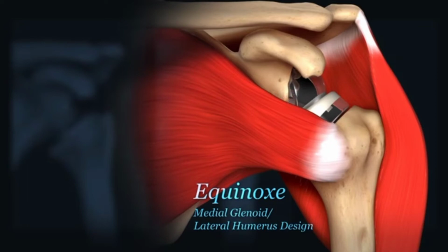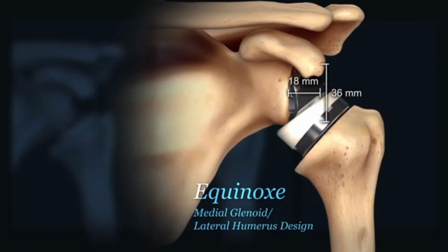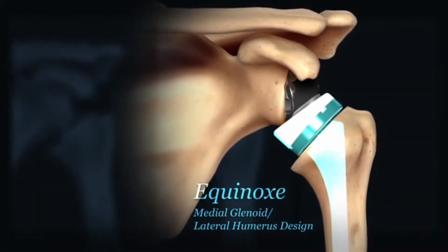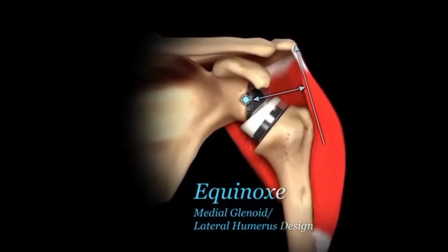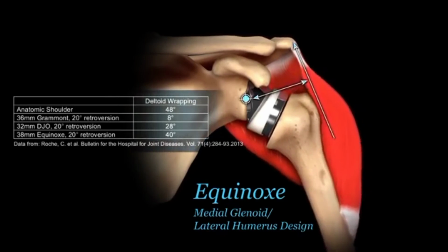The humerus can be lateralized to also minimize scapular notching by decreasing the Grammont humeral neck angle of 155 degrees, proportionally increasing the Grammont glenosphere diameter and thickness of 36 by 18 millimeters, decreasing the humeral liner constraint, and by increasing the medial offset of the humeral prosthesis. Increasing the humeral liner stem offset increases the deltoid abductor moment arm lengths to improve joint efficiency and increases deltoid wrapping to improve stability.